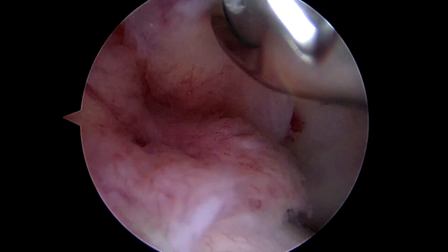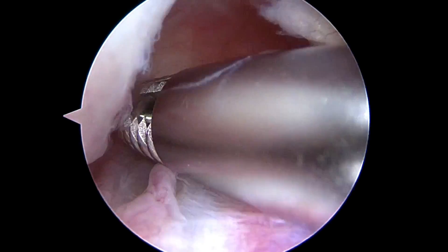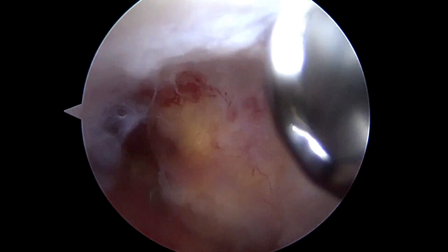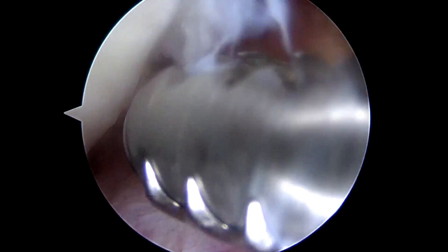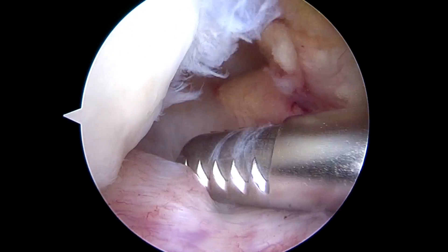Next we'll have a look in the central part of the knee. This is where the ligaments — the ACL and the PCL — are. There's also a structure here called the ligamentum, and we often divide it just so we can see a little bit better. So this is your anterior cruciate ligament right here.